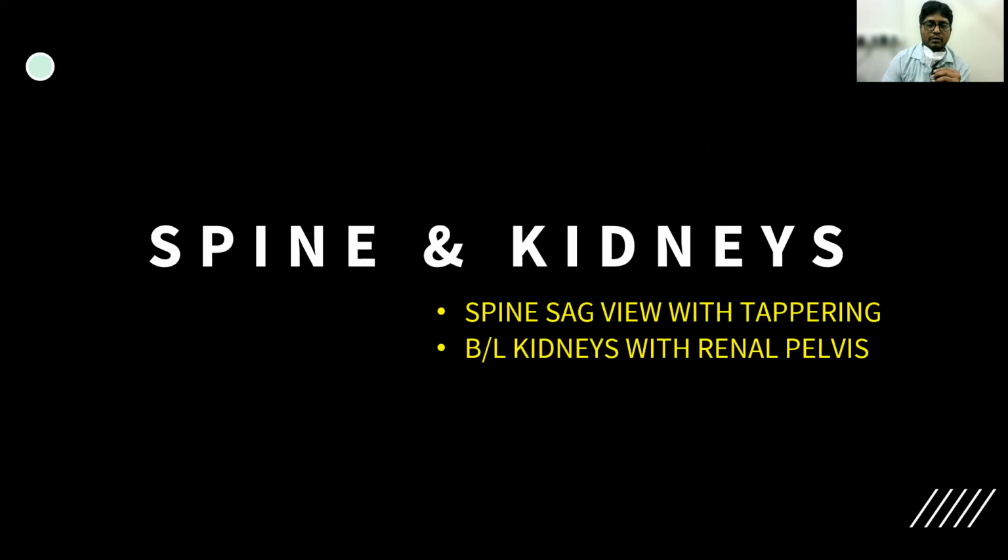The next structure that we have to see is the spine and the kidneys. Now, it is very, very important to see the spine in the sagittal view, in its whole entirety, and in the axial view, so that the skin covers the whole of the spinal cord from the cervical region to the coccyx, which can be well appreciated in the axial images. We should also see the bilateral kidneys with the renal pelvis measurement, and we should measure the renal pelvis in its AP diameter.